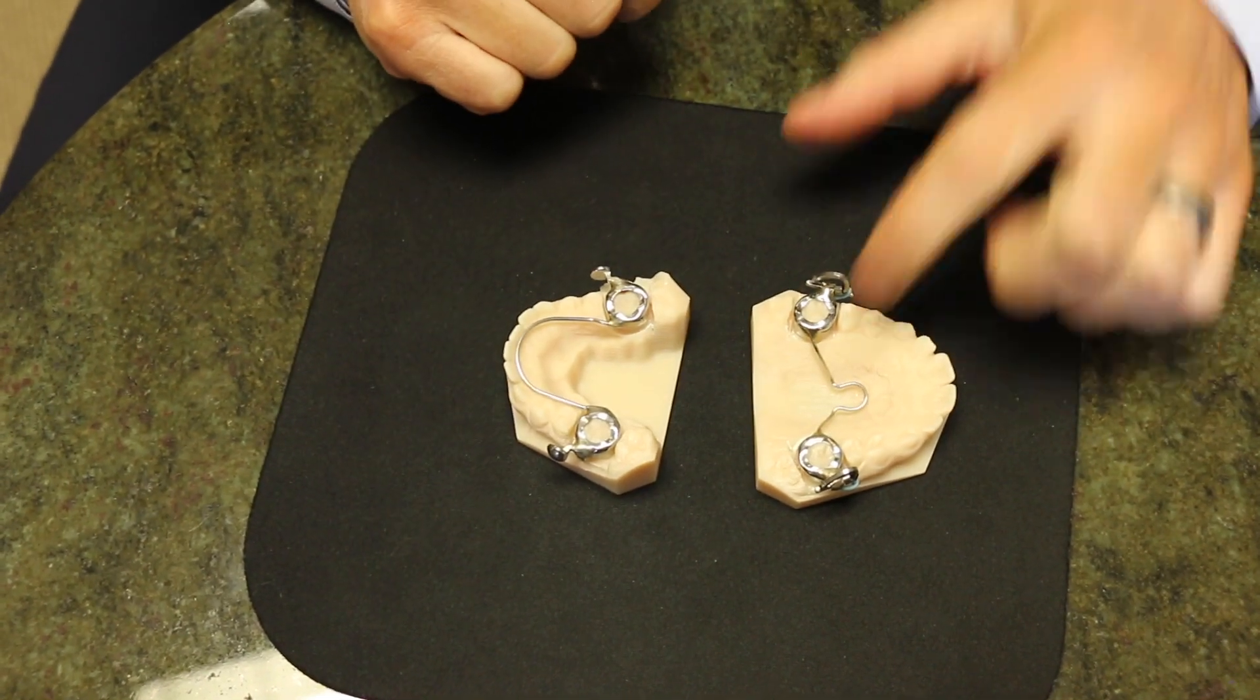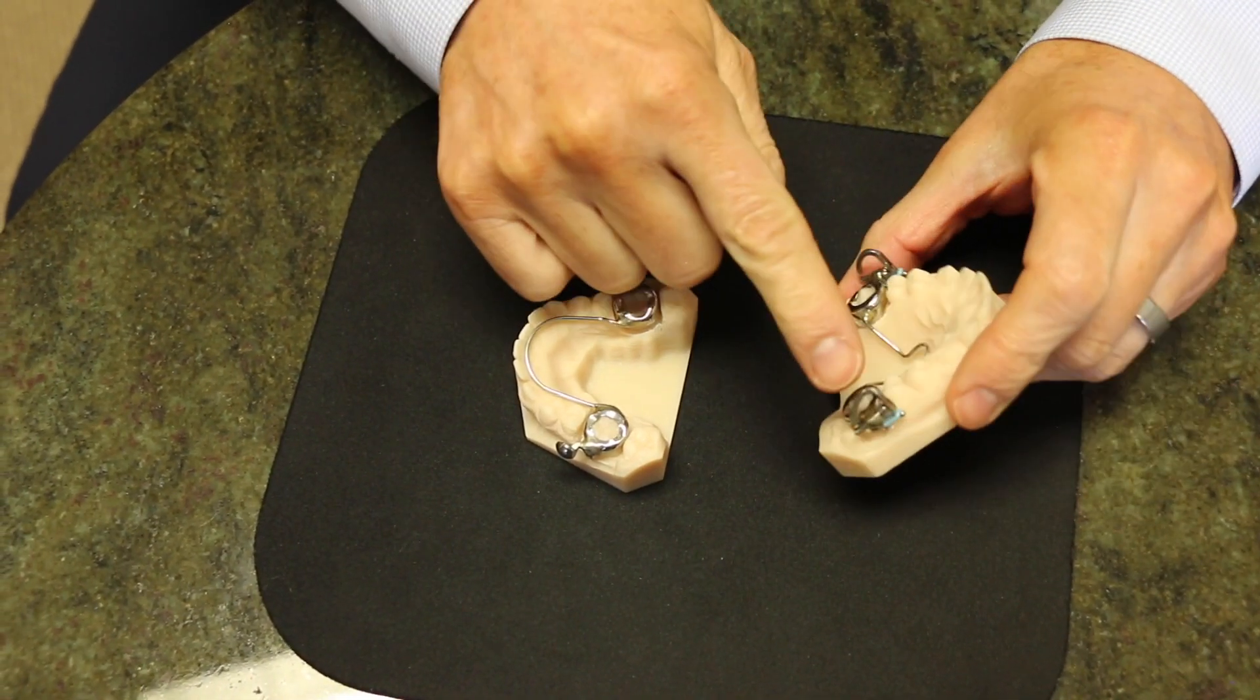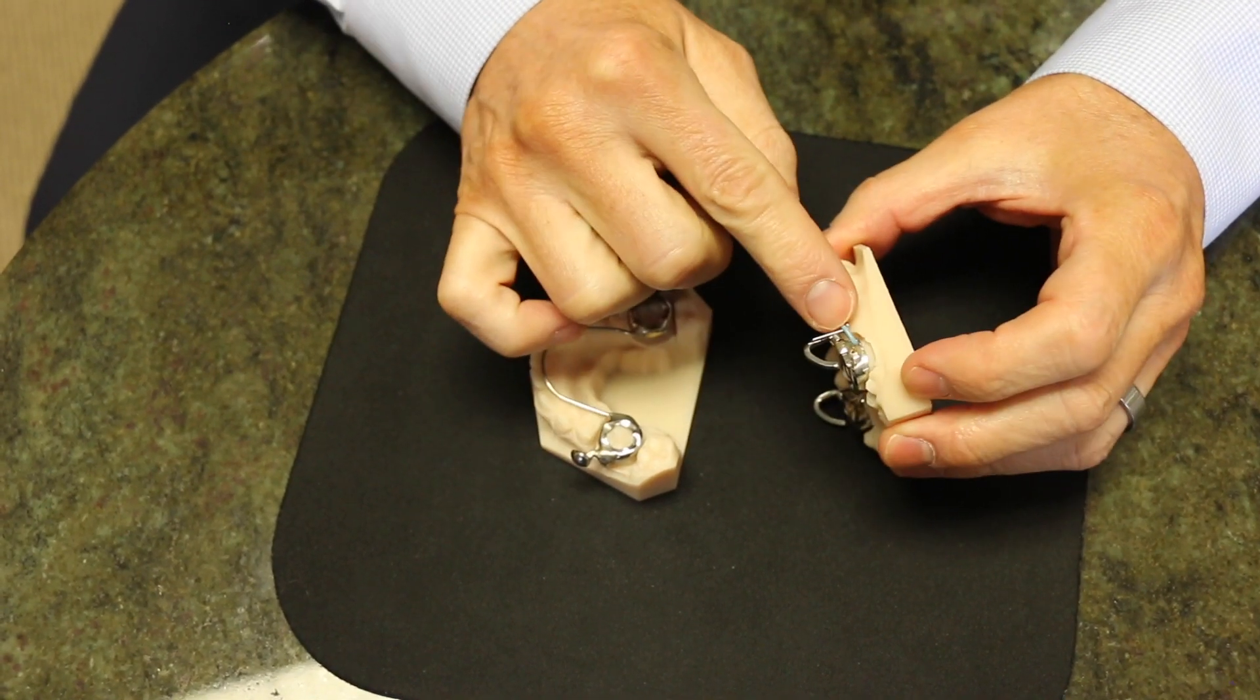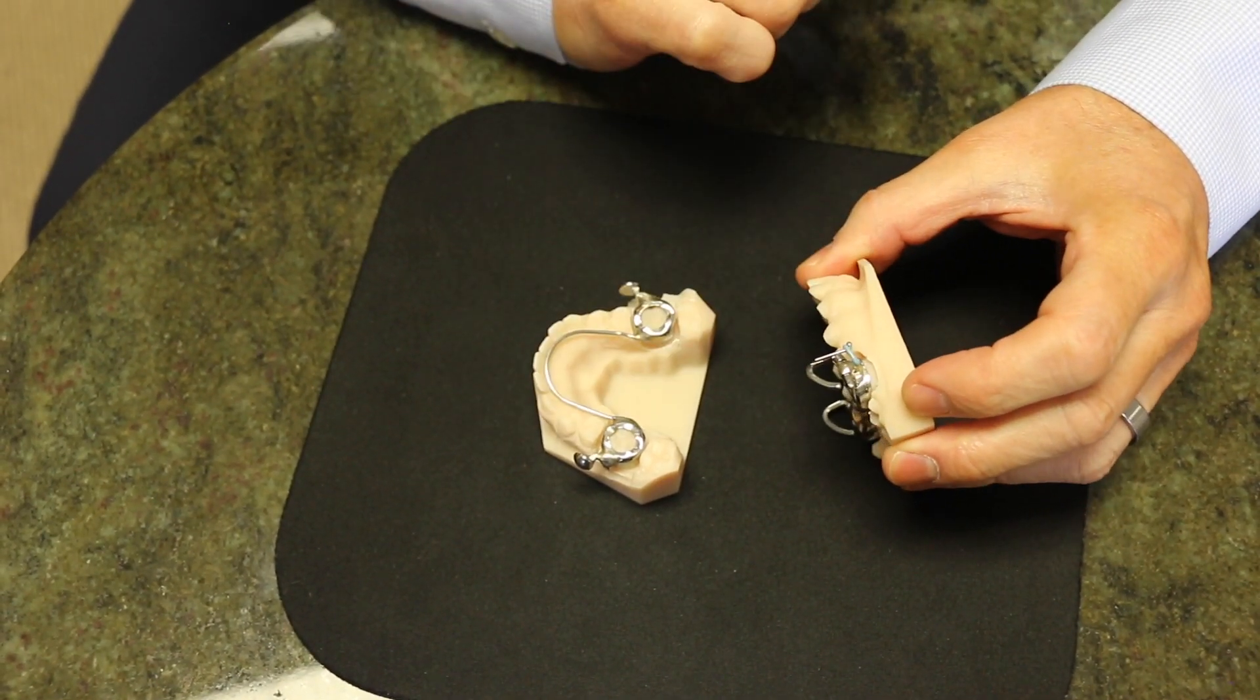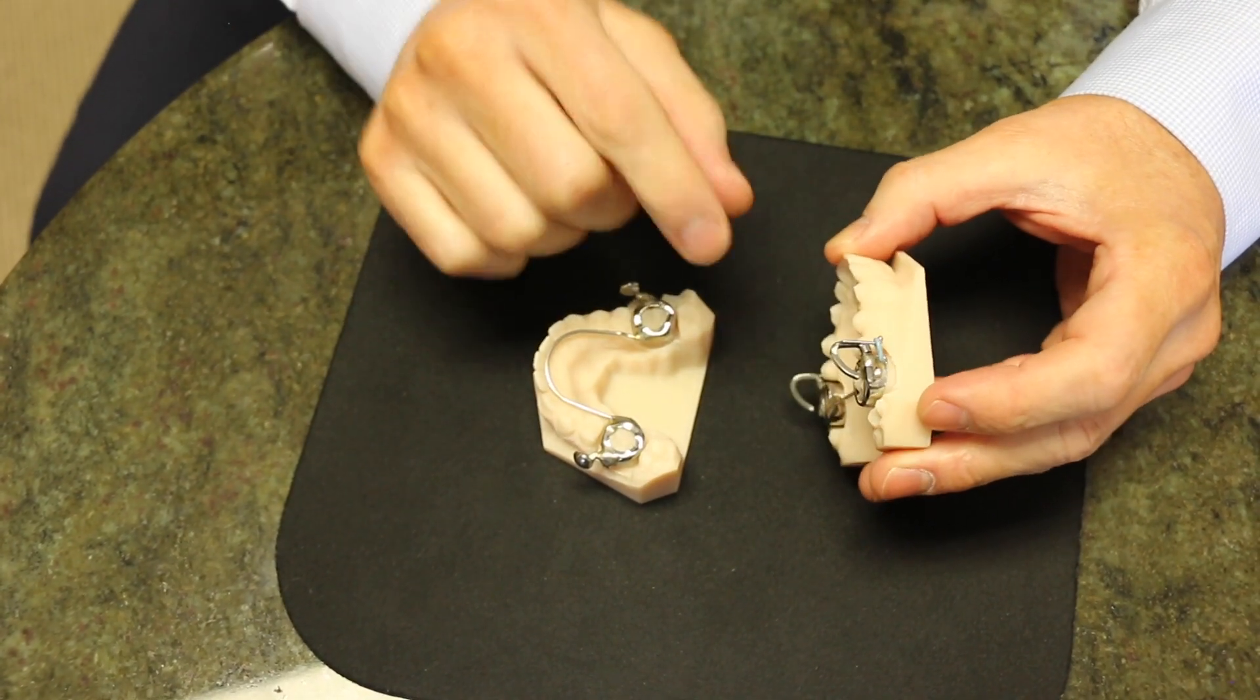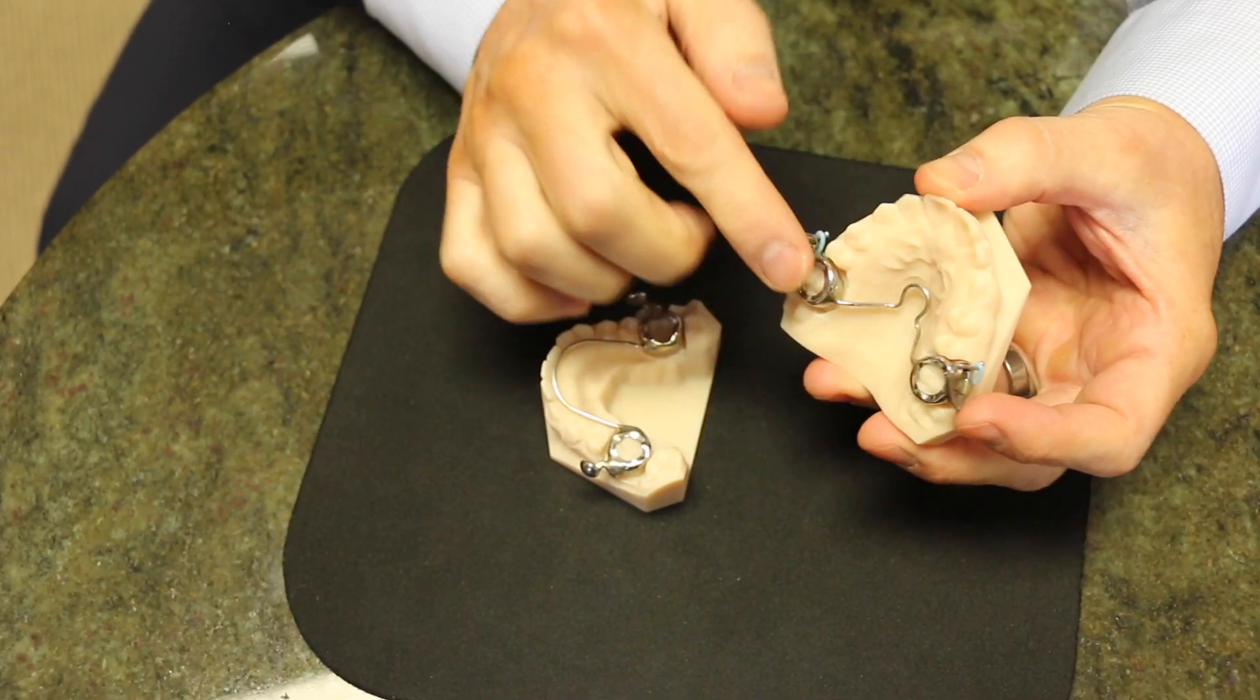It attaches to the molars, the permanent molars in the back, and it has these really odd looking attachments that are removable. We have it attached with a little rubber ring. We call them elbows because they look like an elbow and there's one on each side.